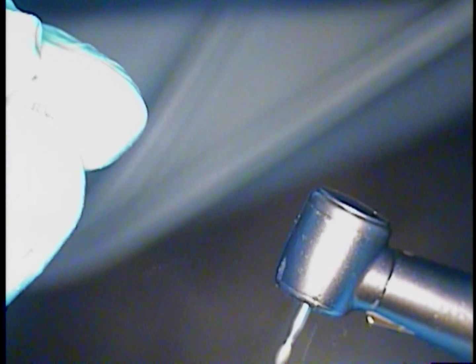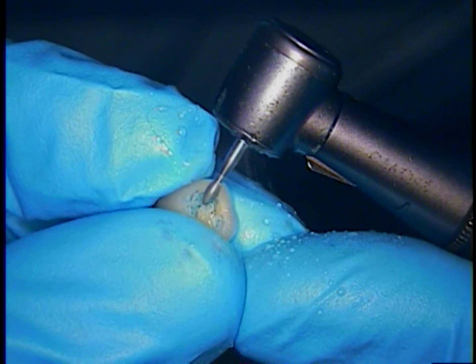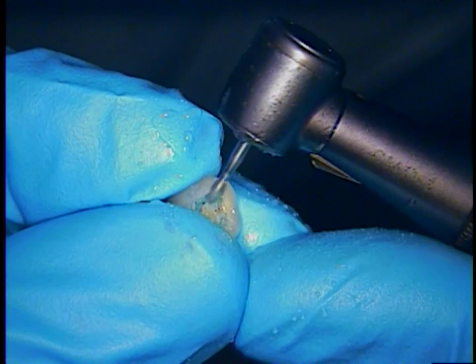I am going to take it out and do some fine adjustments in my hand so that I can look at this directly and make some adjustments. I am going to use a fine football diamond with a little bit of water, less speed, and a lot of movement — low RPM, lots of movement — so we don't heat up the ceramic and cause any fractures.